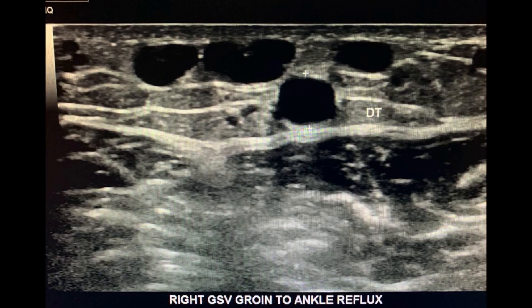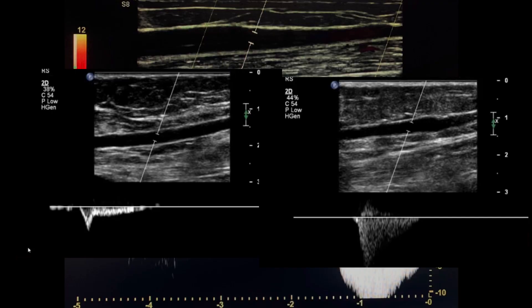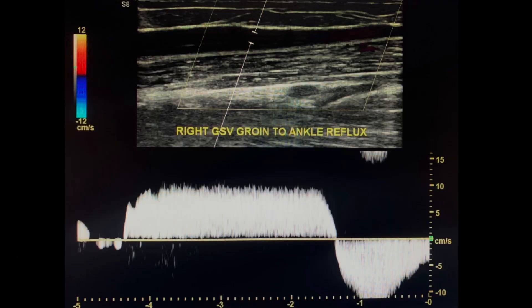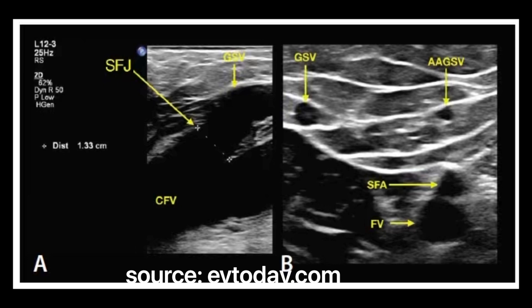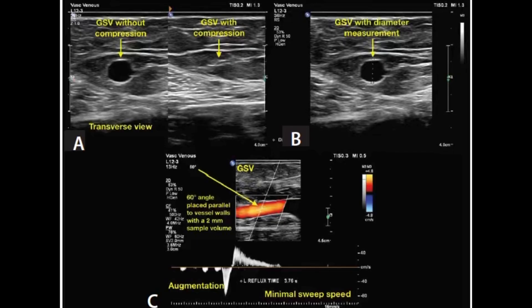Once you've completed the saphenofemoral junction, then you can go on to scan the great saphenous vein. Ask if there's a history of great saphenous vein harvesting for prior coronary artery bypass grafts. Scan the great saphenous vein for competence throughout the thigh with proximal compression. Reflux time greater than 0.5 seconds is a positive finding. Identify and locate if the patient has any accessory great saphenous veins. Check for competence, measure the diameter, and assess for reflux.